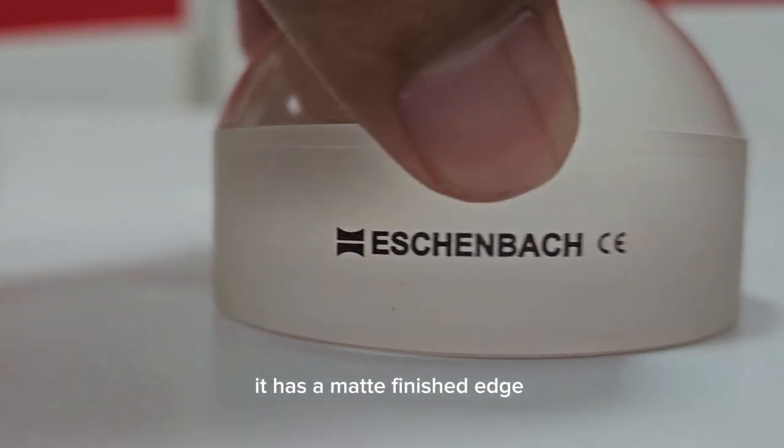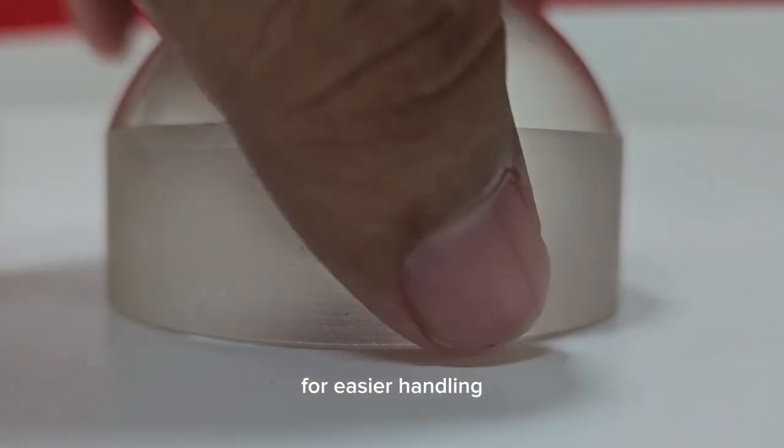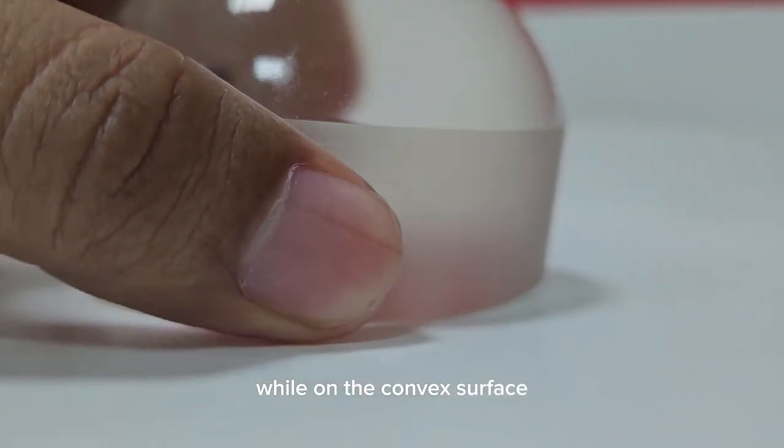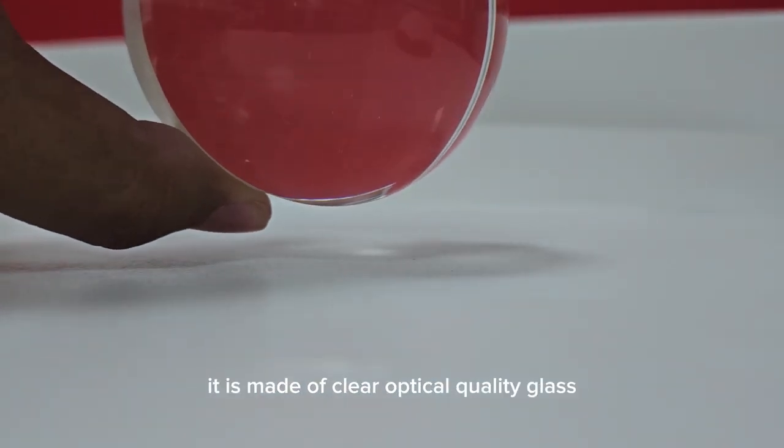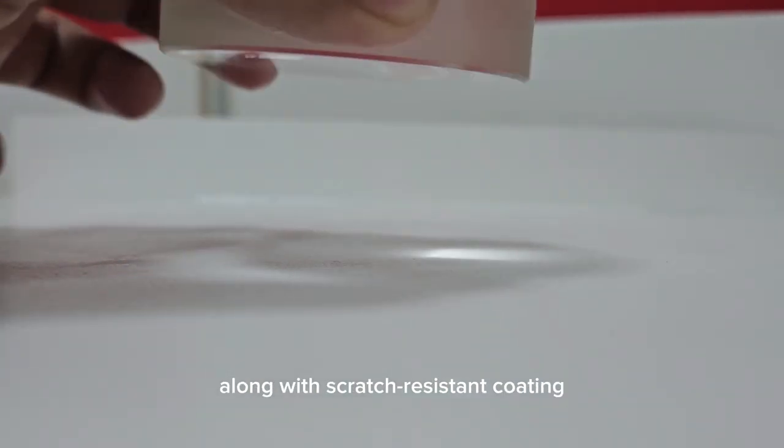It has a matte finish edge for easier handling, while on the convex surface it is made of clear optical quality glass, along with a scratch-resistant coating.